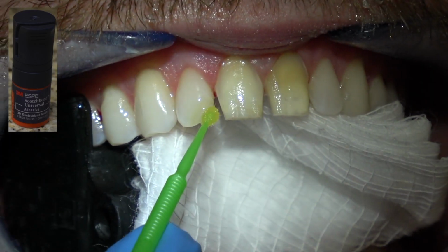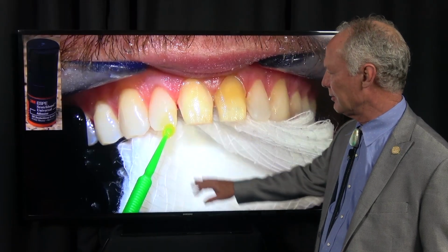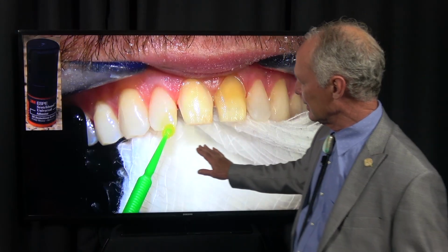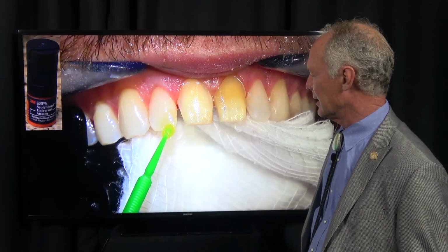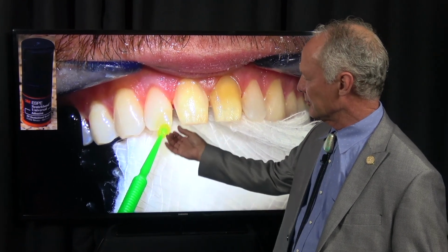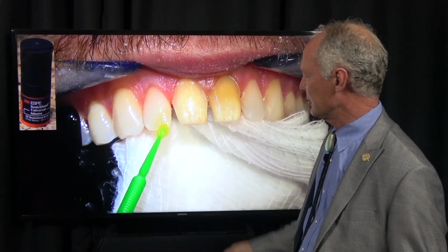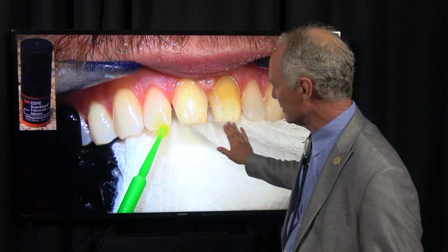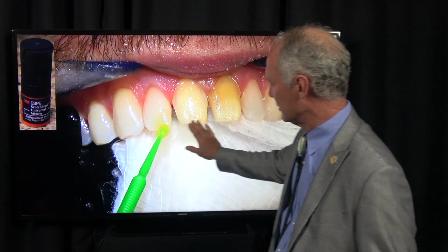Then I'm going to isolate with a 2x2. Some of you will say, well, why don't you use a rubber dam? The key is not rubber dam or some other means of isolation, it's isolation. And this is a lot simpler in the anterior because I'm not anesthetizing the teeth. So I don't want the rubber dam clamp to pinch the gingival tissue around the tooth that's being clamped. So I'm just isolating with a number of 2x2s in the mouth.